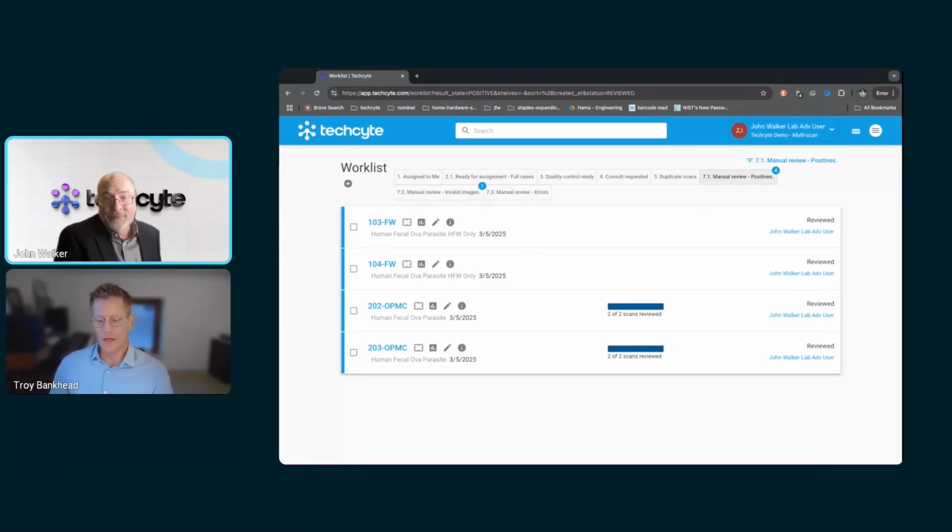Wonderful. Thank you for that, John. Really appreciate it. One of the things that you will have noticed as John was going through the reviews is the presence of false positives. And that's one of the aspects of the system. This is not a primary diagnostics device. It is meant to have a trained professional. And so we've tuned our system to not miss organisms.